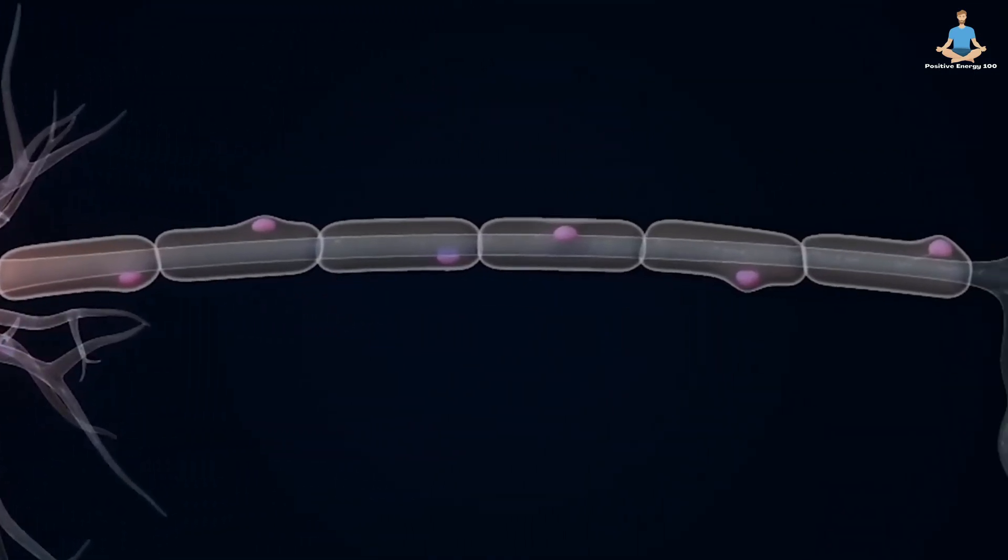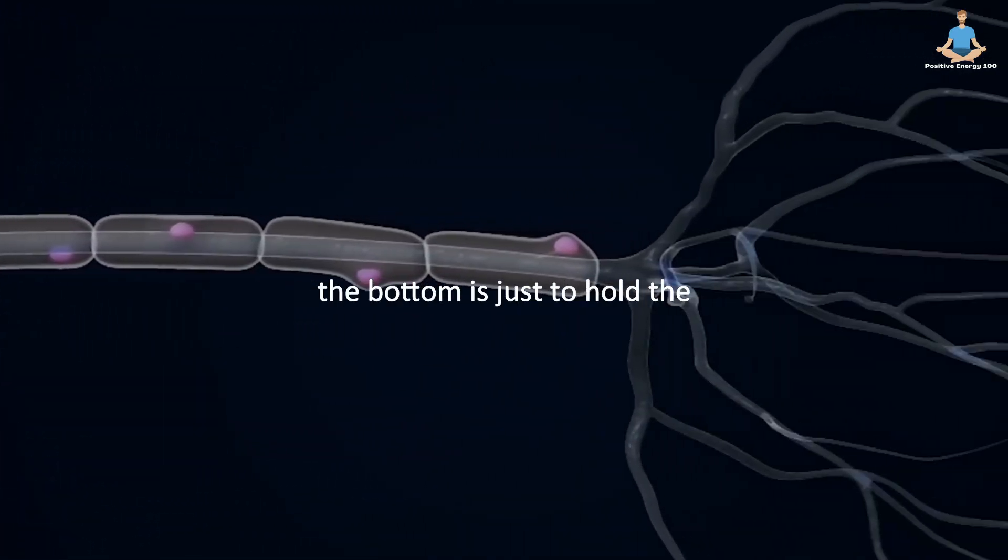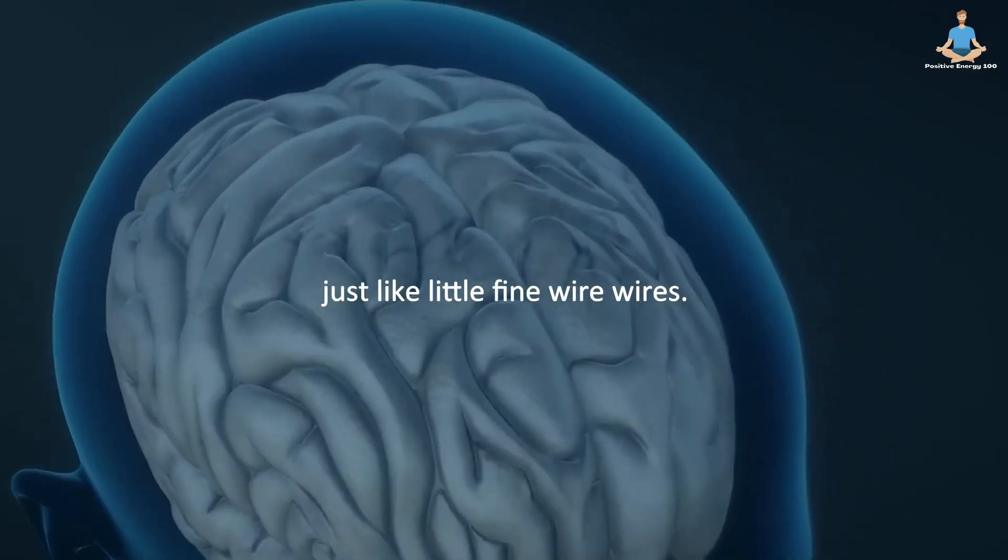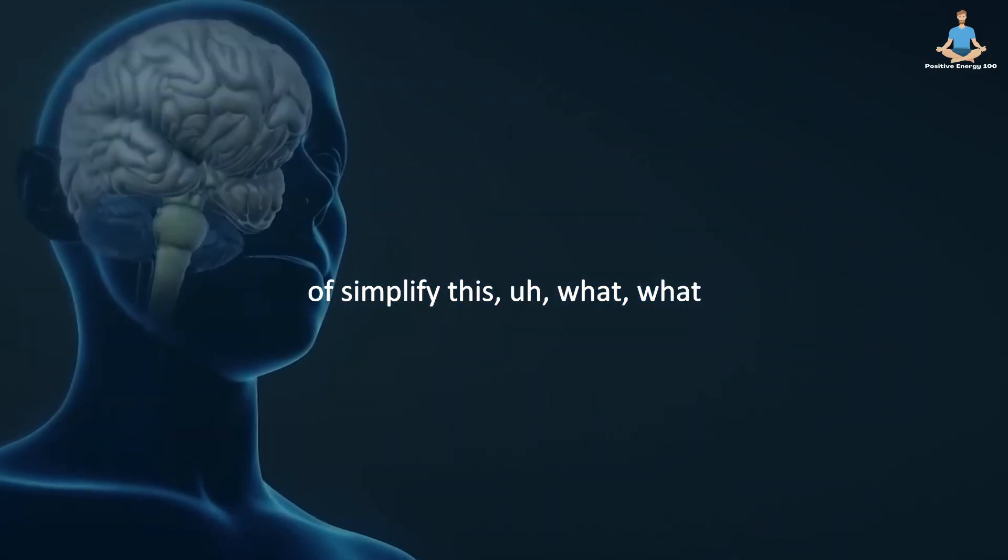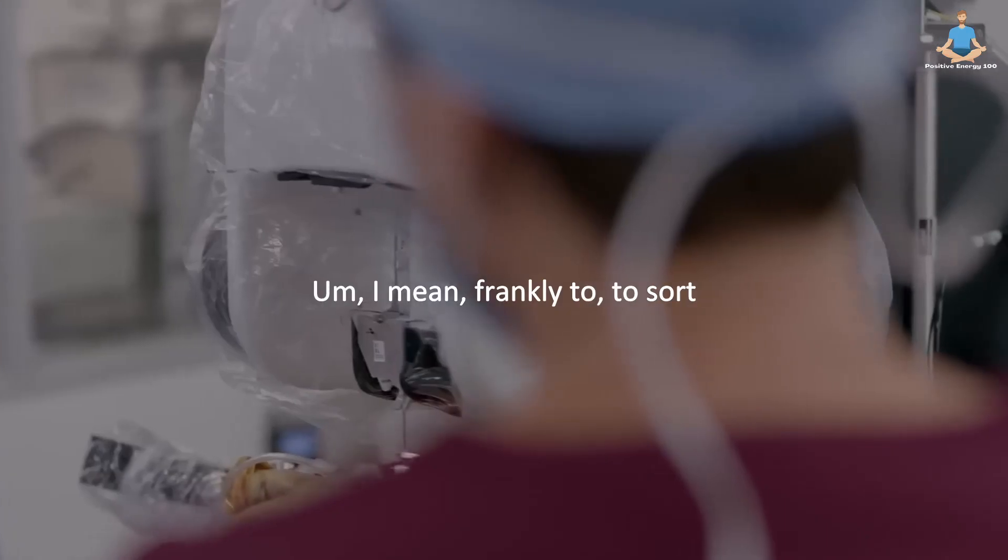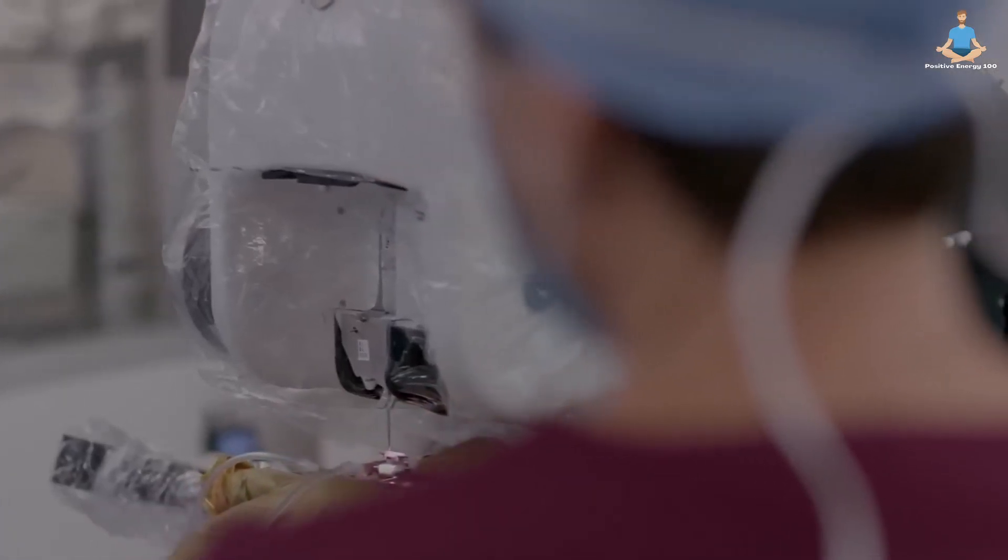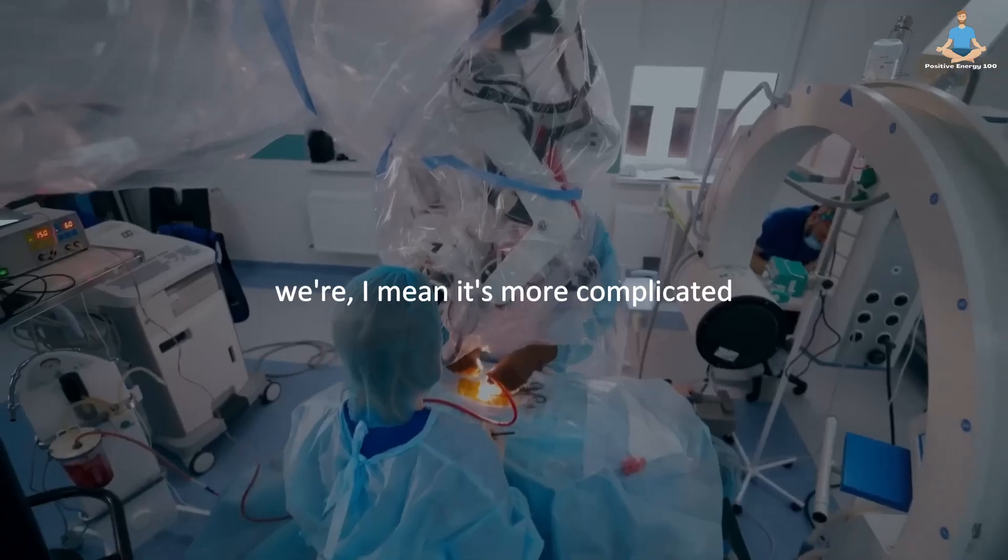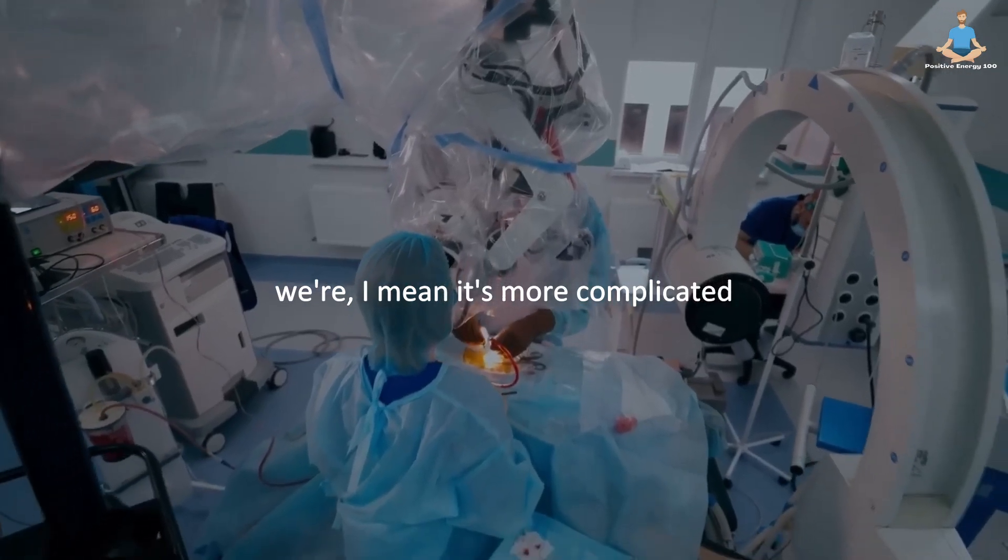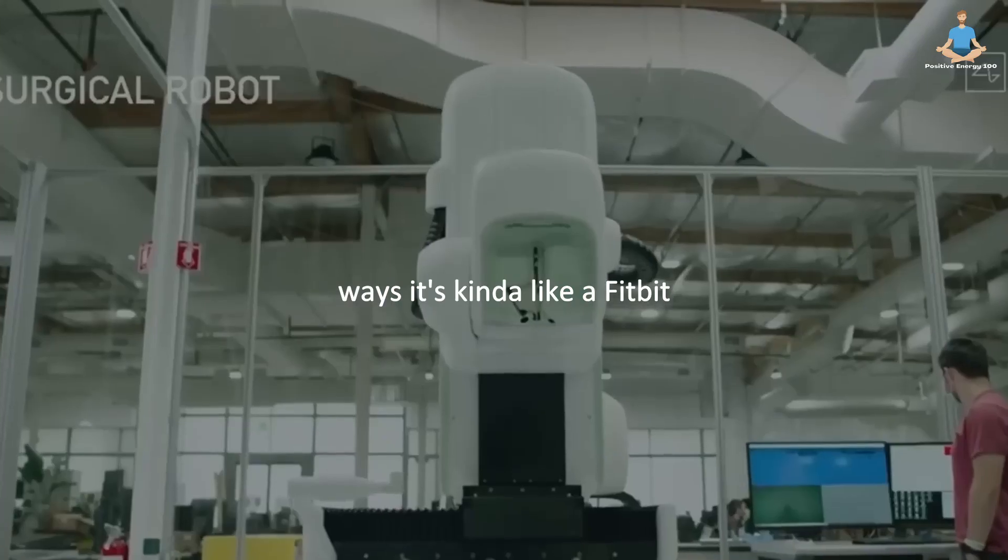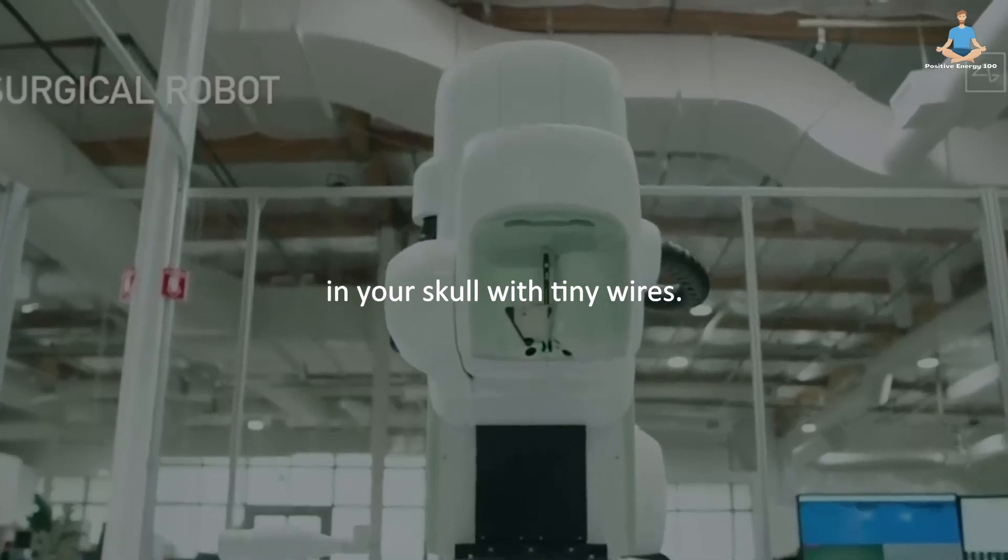This is that little device. That thing at the bottom is just to hold the threads in place because they're just like little fine wires. I mean, frankly, to sort of simplify this, it's more complicated than this, but in a lot of ways it's kind of like a Fitbit in your skull with tiny wires.